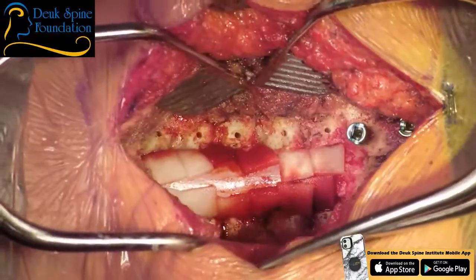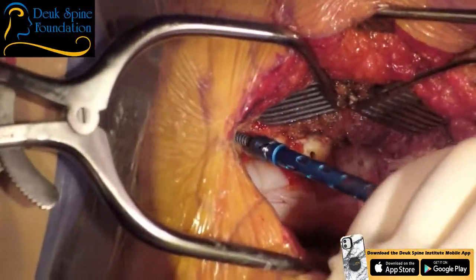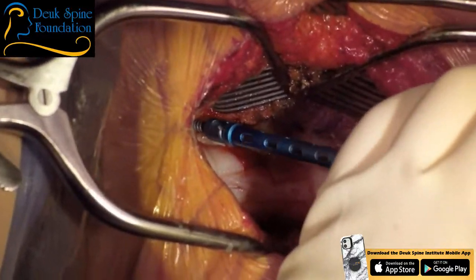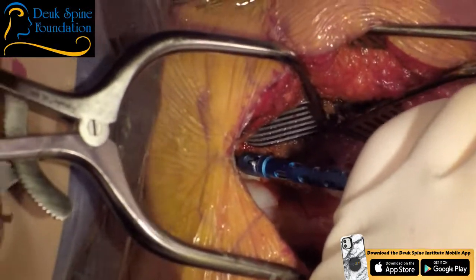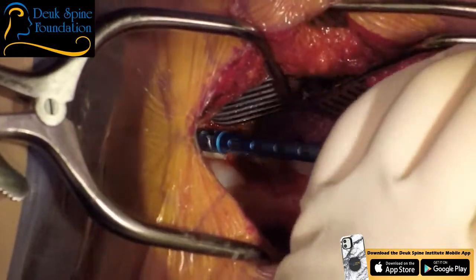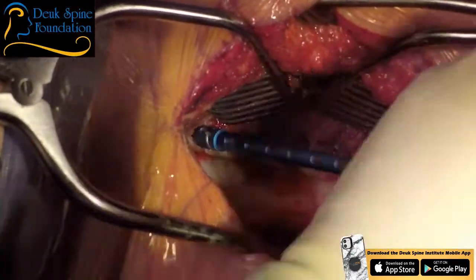Now we're going to do lateral mass screws. So these are angled completely different. They're up and out, 20 degrees. Okay. And these are 14 millimeters, by the way. I don't put 16 millimeter lateral mass screws. I've never had a problem with 14.